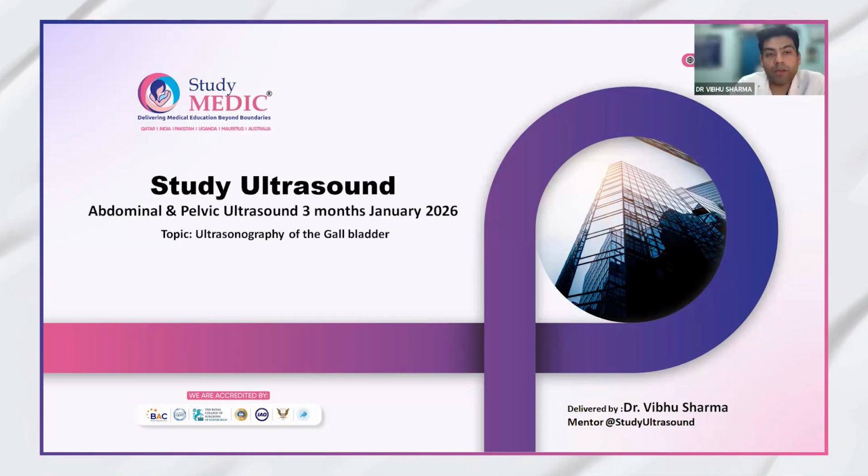We will be today doing just a presentation on ultrasonography of gallbladder, as it is a vital organ, and imaging is very vital to know about the pathologies of gallbladder.